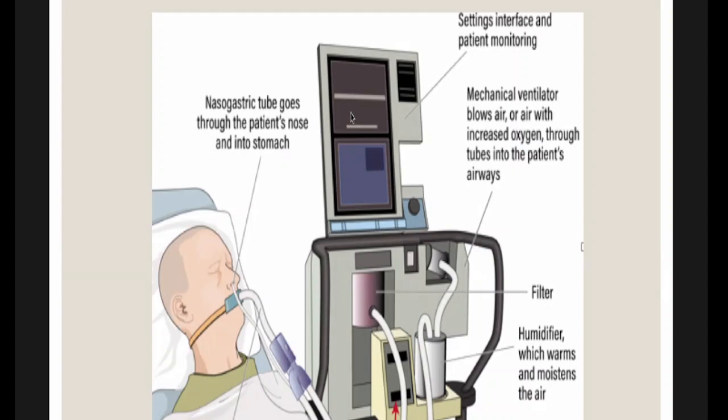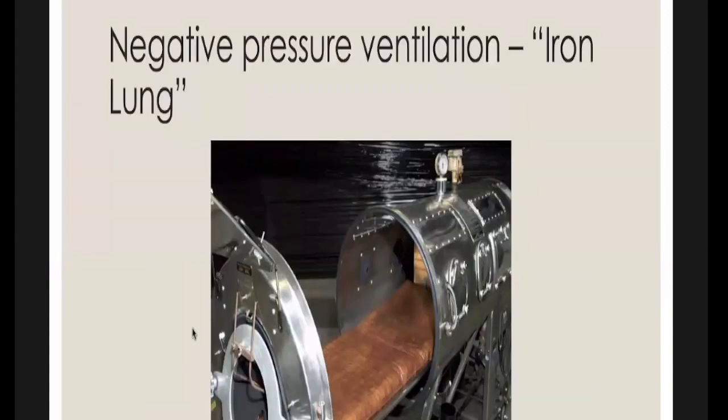Okay, so the volume delivery and the gas exchange will be affected based on the patient's lung condition. Because of that, you have to see what the patient really gets on this screen. Just to have a little interest on this, this is the iron lung.